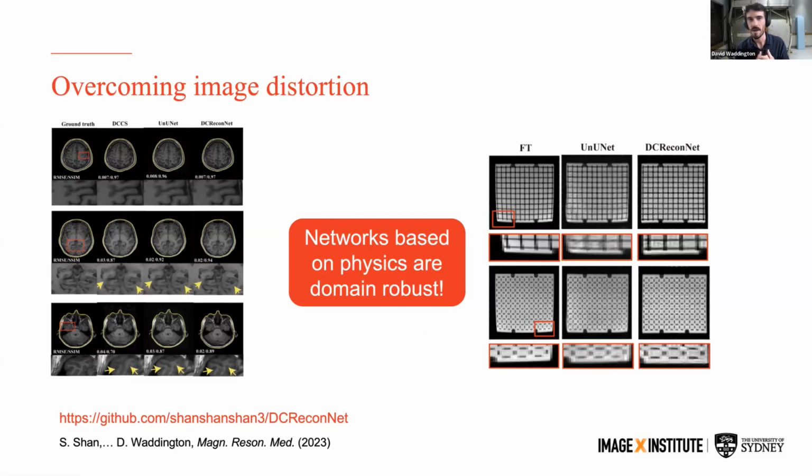are being developed in a way that they will hopefully, when used more out of domain on other MRI scanners, other vendors' platforms, be robust to these domain shifts that plague AI deployment in particular.